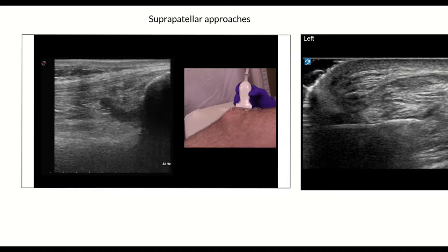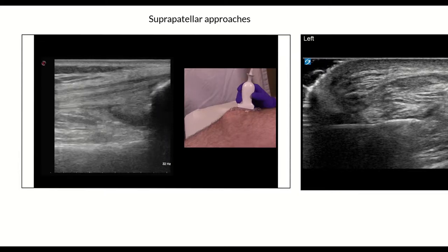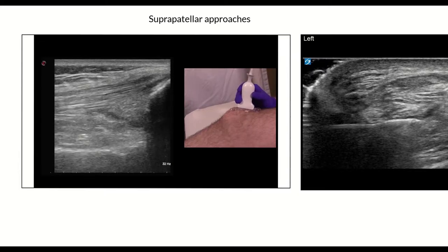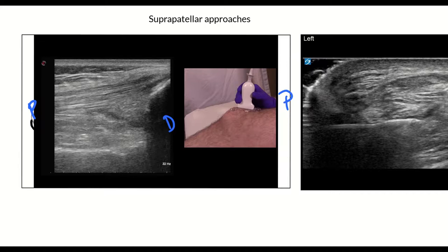First we are going to start with the sono anatomy along the distal thigh, or what we call the suprapatellar region. This is a video of a suprapatellar positioning for the ultrasound transducer. Notice that proximal is on the left for the ultrasound images and proximal is on the right for the video images. In this particular individual there is a small effusion, and this knee is at 30 degrees of flexion.